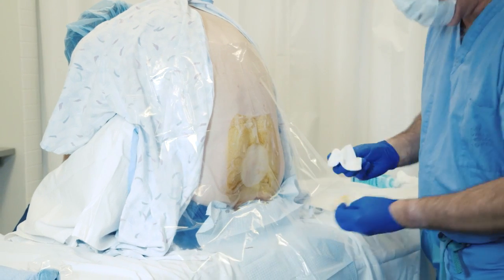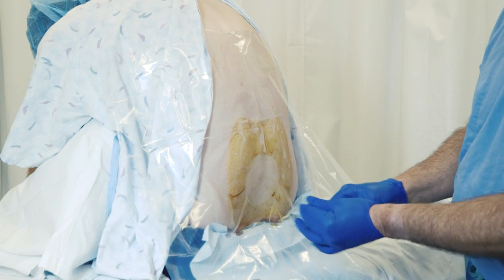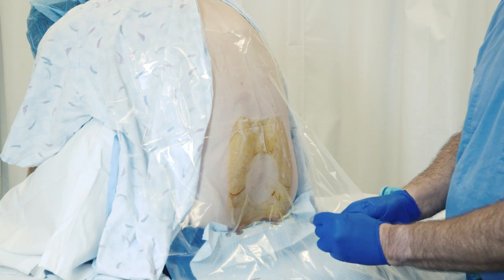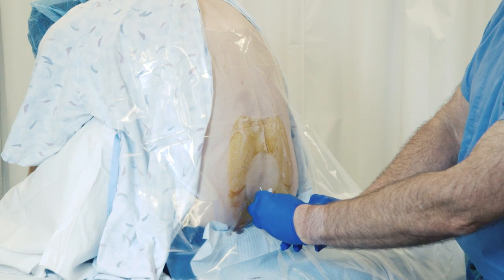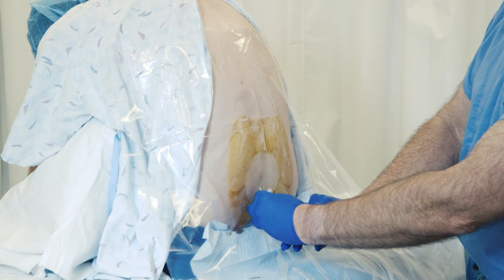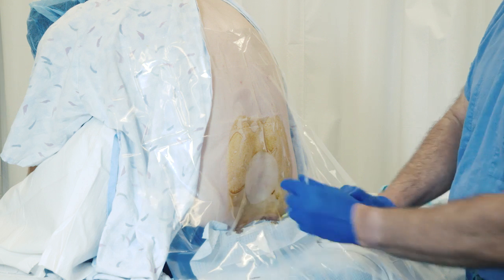Prep the needle insertion location and perform the injection according to standard protocol, recalling the depth conveyed in the SpineNav 3D scan.